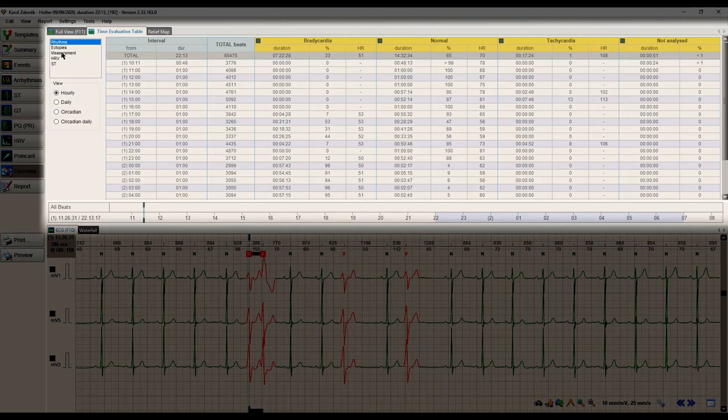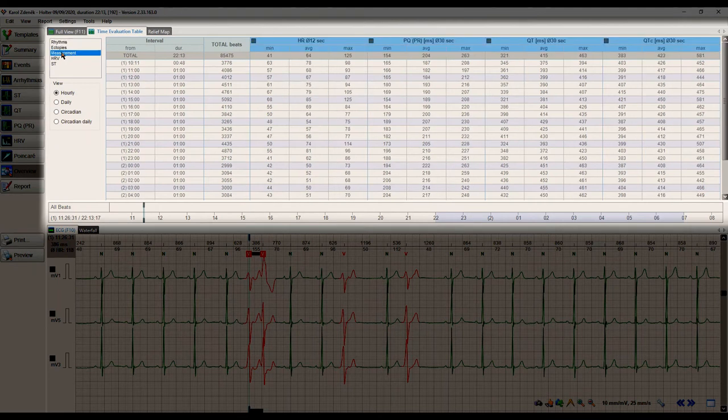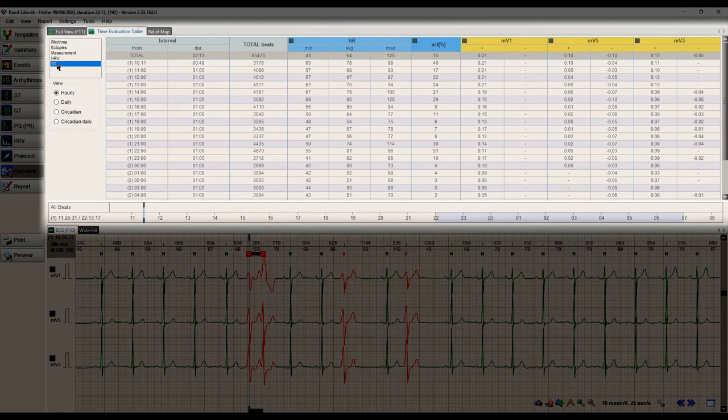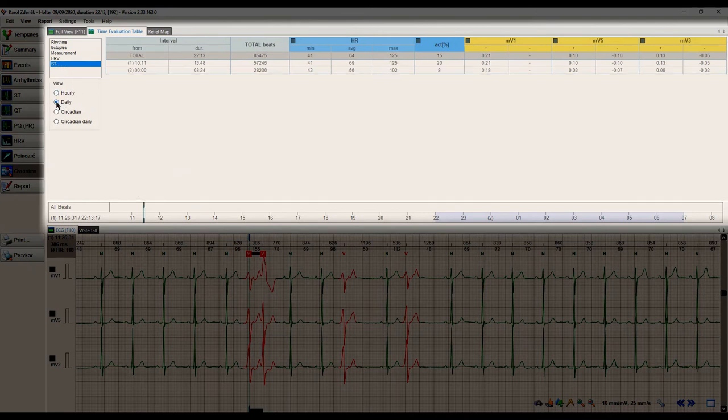Using this table allows us to view and check a wide range of statistics computed over selected time periods such as hourly, daily, circadian and circadian daily.